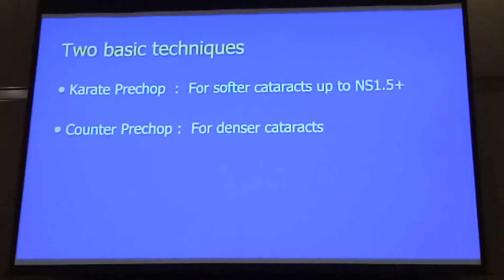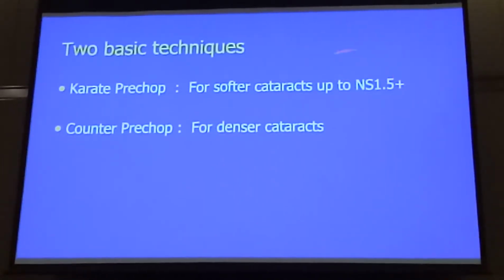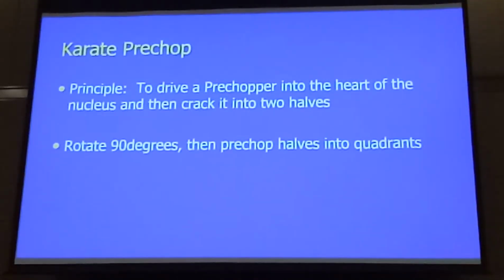So when we think of manual pre-chop, there's two. One is the karate pre-chop, where you can do this for softer cataracts up to maybe 1.5 plus nuclear density, and for denser ones, 2 plus or above, you need a counter pre-chop. In other words, you need something to support the nucleus before you crack it into the segments, and you use that for denser cataracts.